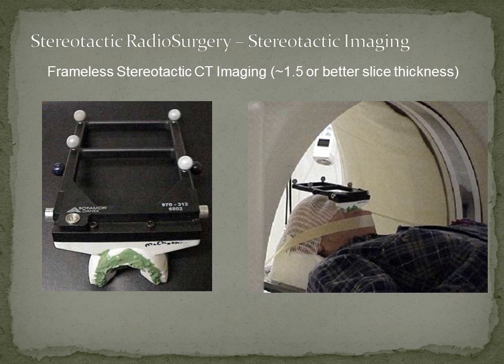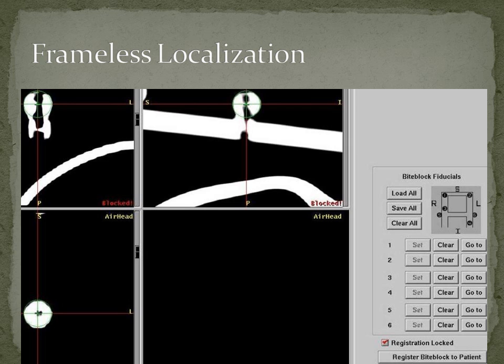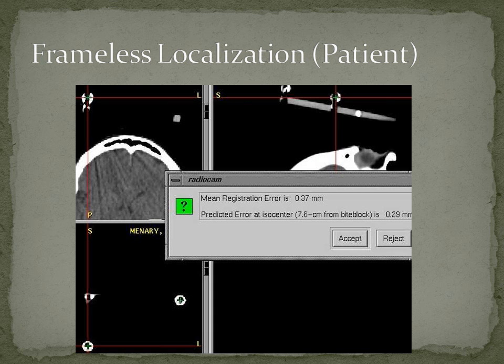Here's the CT scan. We went through and just as we did with the ring systems, we put QA into the scanner link so that when we actually image these and we reconstruct this bar of where these balls are, we actually can figure out the overall error of imaging, and that's part of the system.